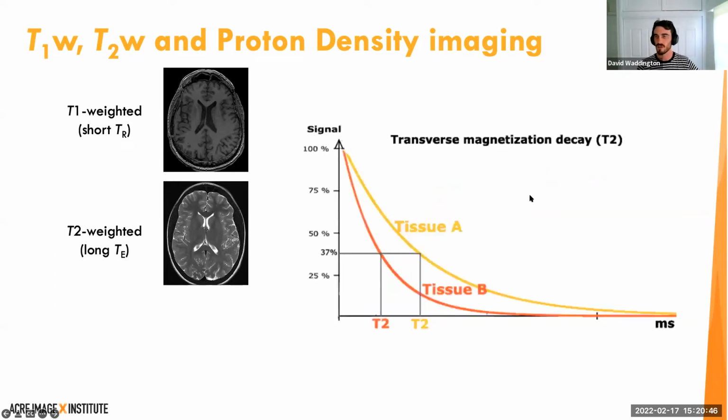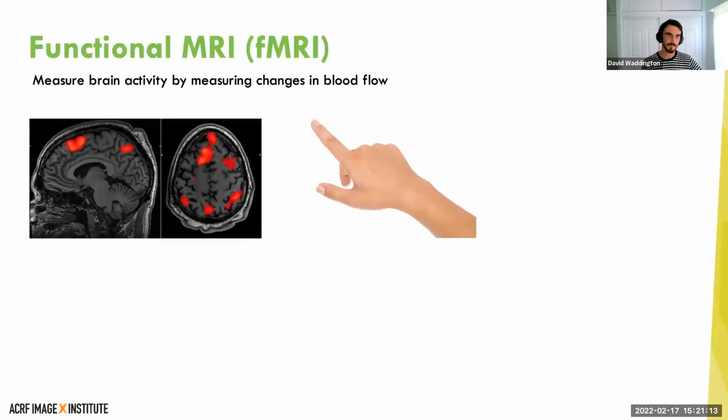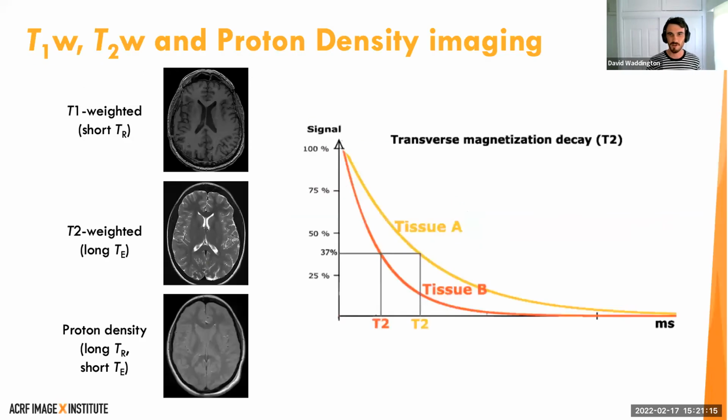And then we can also do what we call T2 weighted imaging, where we tune the echo time, the time after we start our spins precessing that we acquire an image. So we can also tune times and get different signal intensities between tissues. And then we can do combinations of that, which give us other sorts of information as well, in this case just the overall proton density. Okay, so T1, T2, TR, TE. They're the 4 important things.